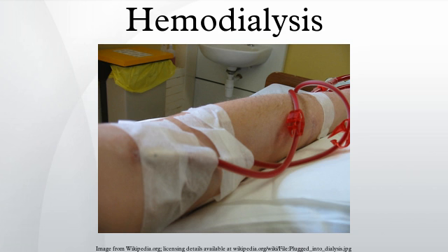This research showed that life could be prolonged in patients dying of renal failure. Willem Kolff was the first to construct a working dialyzer in 1943. The first successfully treated patient was a 67-year-old woman in uremic coma who regained consciousness after 11 hours of hemodialysis with Kolff's dialyzer in 1945. At the time of its creation, Kolff's goal was to provide life support during recovery from acute renal failure.